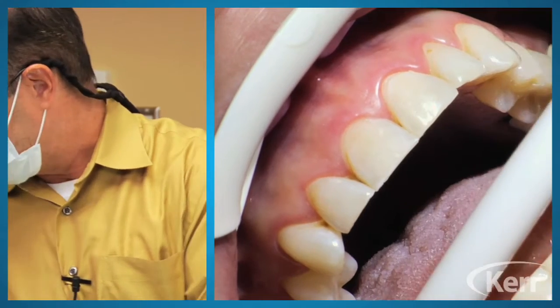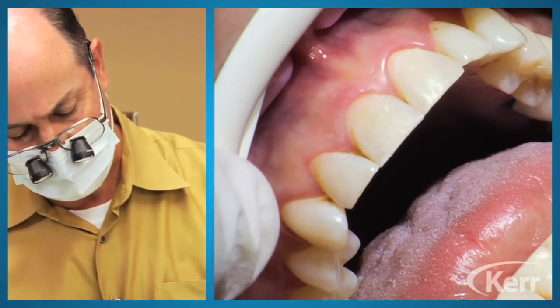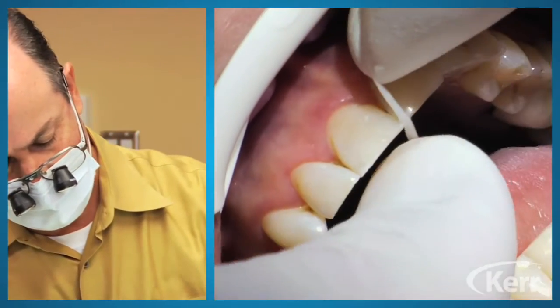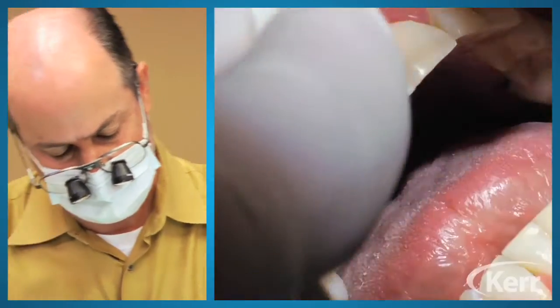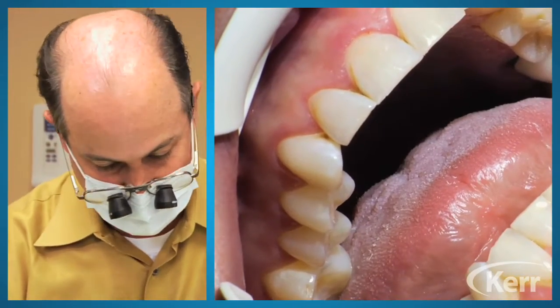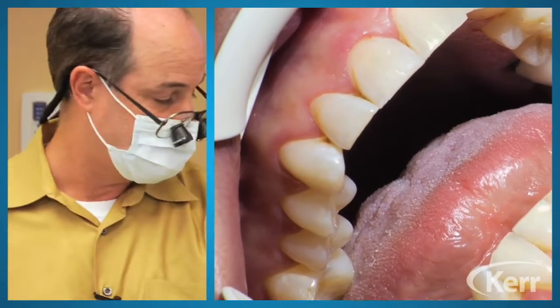Let me see a piece of floss, Edwin, please. So, we should be able to floss. Basically, I took the material right up to the adjacent tooth because that plumber's tape is very, very thin. Let me have a medium disc.